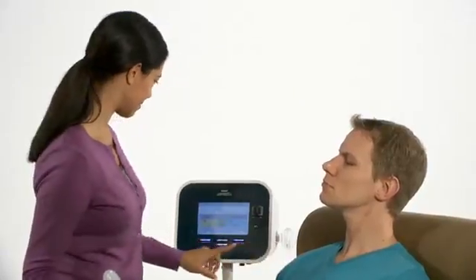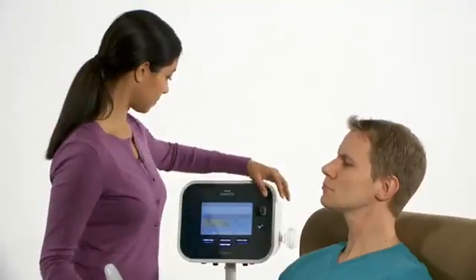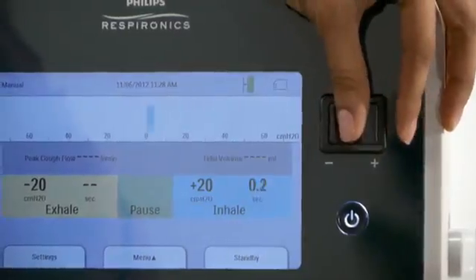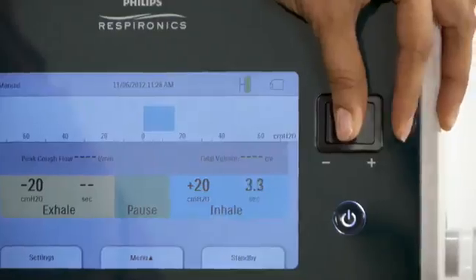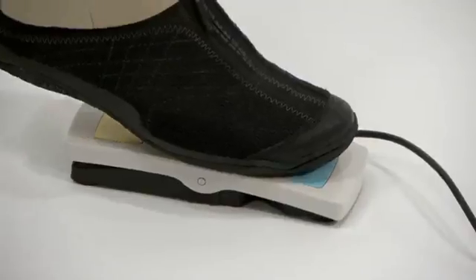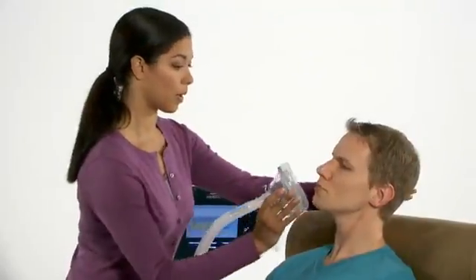Press the rectangular right button below Therapy to begin treatment. If you are operating CoughAssist T70 in manual mode, slide the control lever to the right to trigger an inhalation, or press forward on the optional foot pedal. When the inhalation is complete, slide the manual switch to the left or press back on your heel for an exhalation. Position the mask, mouthpiece, or trach adapter on the patient.